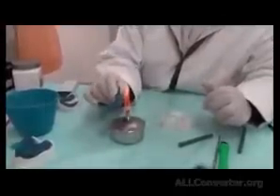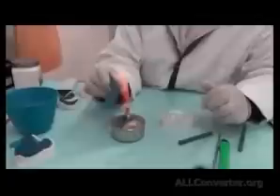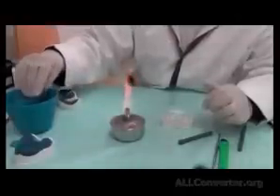Before I do that, I give it a shine, giving it heat as well to be soft. Put it in warm water to cool down a bit, not to burn the patient, and then put it inside the patient's mouth and then border mold. On the cast, we're going to press it by our fingers, but in the patient's mouth, this is the upper, we're going to pull down the upper lip, go back and forth with it, and do this circular motion with the lip. So I hold the lip, put it down, and begin doing a circular motion.